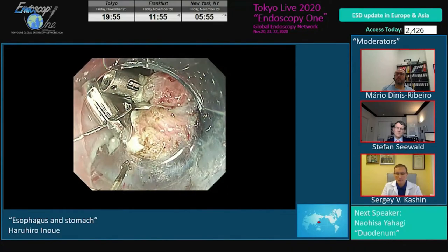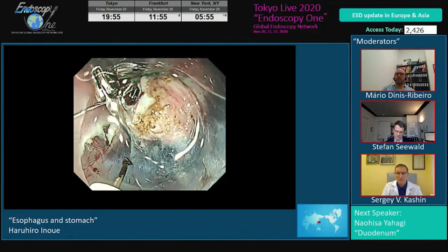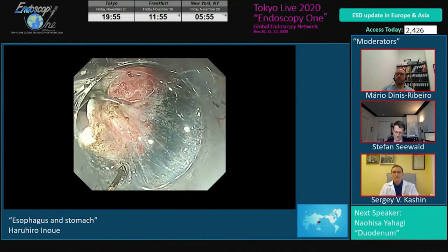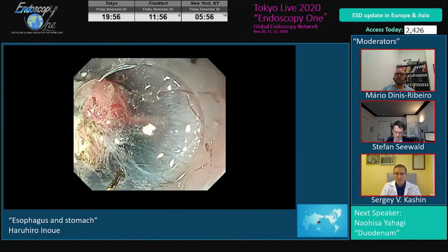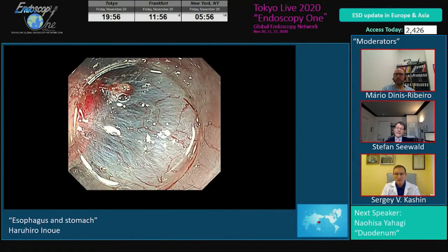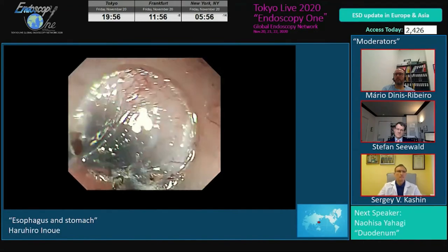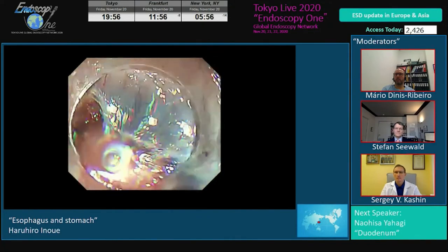Even a lateral edge. Usually a lateral edge is very difficult to dissect compared to the center, but with multi-point traction, the snare closure makes the lateral wing roll up. Then we can make a good submucosal dissection. Like this, using the multi-point traction and then snare closure, the specimen itself rolls up, and even the lateral side is widely open. So we can perform a relatively easy submucosal dissection even on the left lateral and right lateral side, like this.